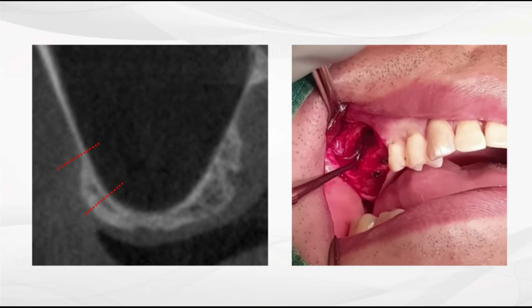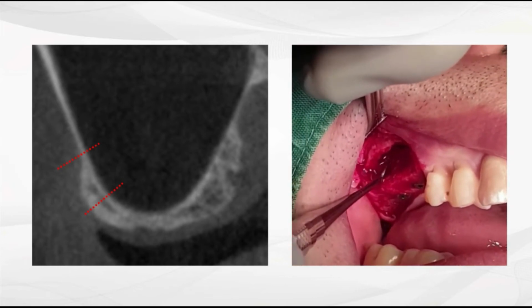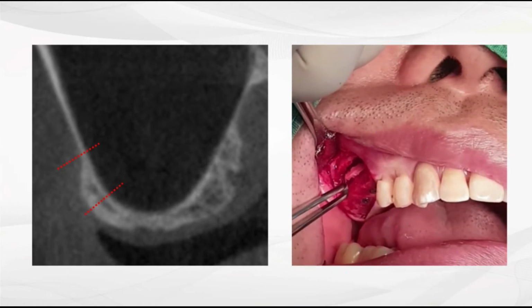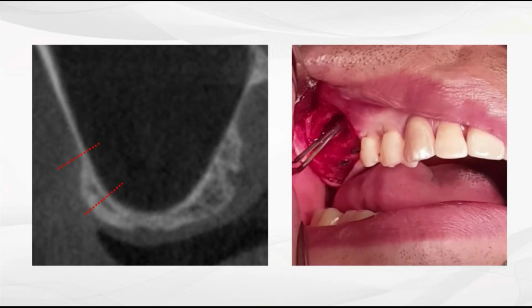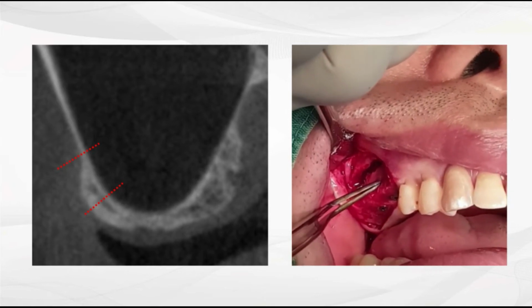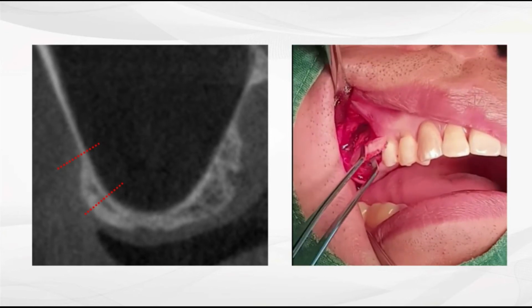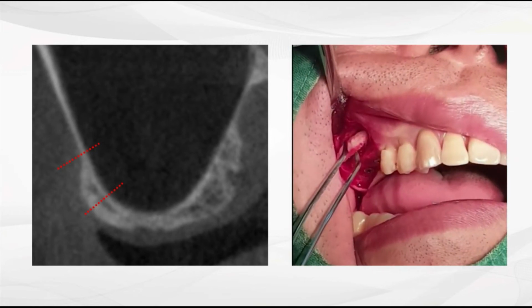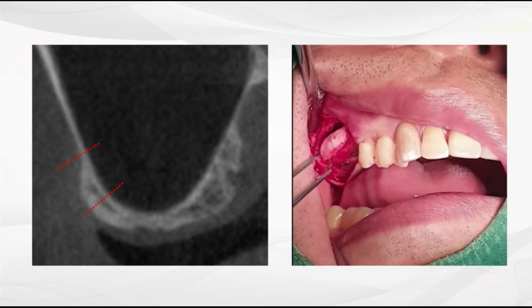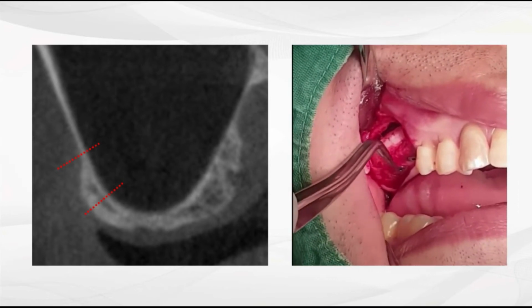And finally, the lateral cortical bone was repositioned to the roof and the lateral side of Moldable AutoBT to build up a whole implant housing in the sinus cavity. Especially, no additional fixing tool is necessary. To remember, no additional fixing tool is necessary. And then leave the gap at the window opening side to use as a drain route of blood from the sinus cavity, and suture without any membrane application.